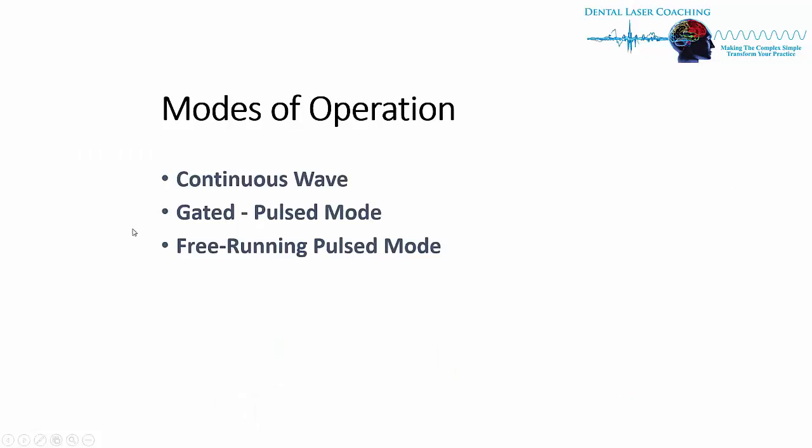So some of our modes of operation now that we know how the laser energy is created and how the energy is outputted by specific arms, tubes, or fibers, now, how do we release energy? We have three different options.